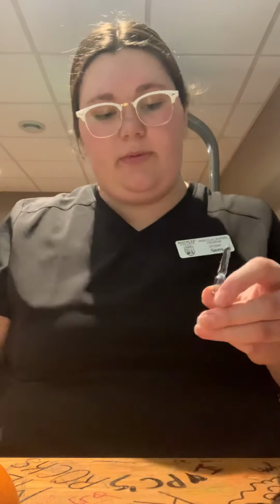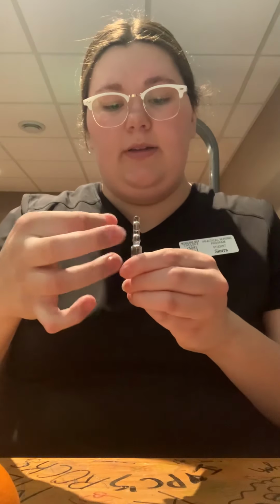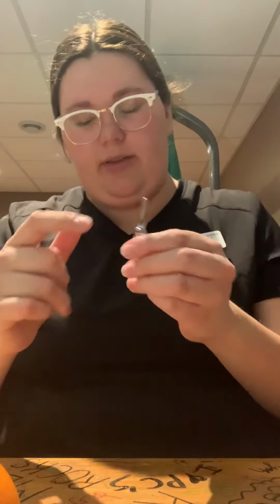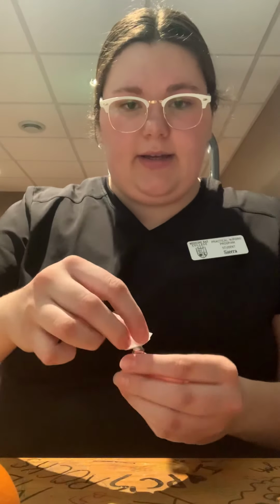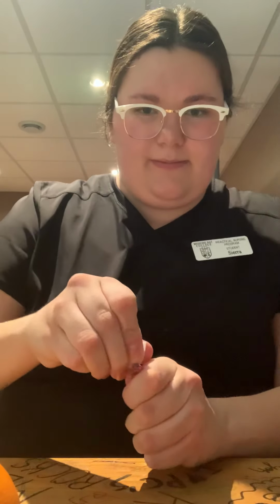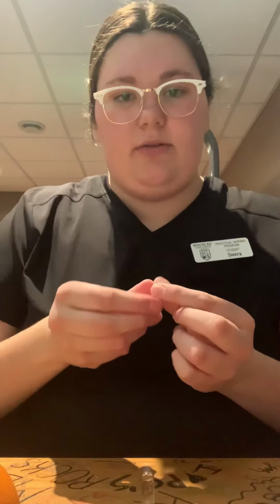So for opening an amp, at first we want to make sure that there's no medication in the top of the amp. So we're going to flick it quick to make getting all of the medication into the bottom and out of the neck. With a piece of gauze, we are going to break the neck of the amp away from our hands. So doing that, breaking it and setting it back down. This, because it's glass, needs to go into the sharps bin, so I will dispose of that in the sharps bin.